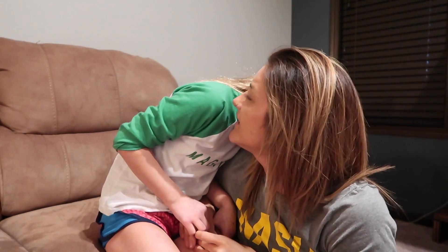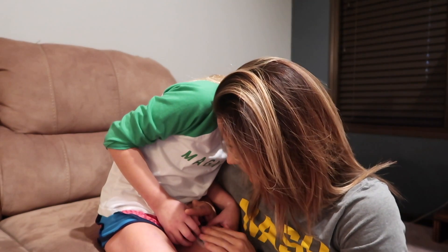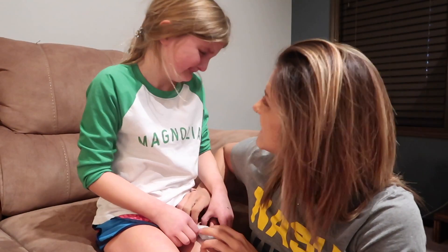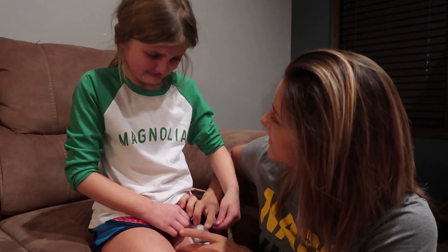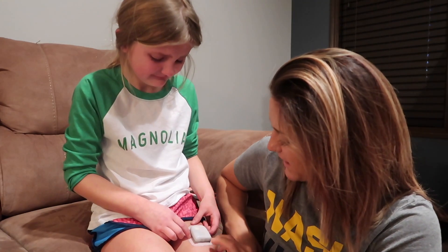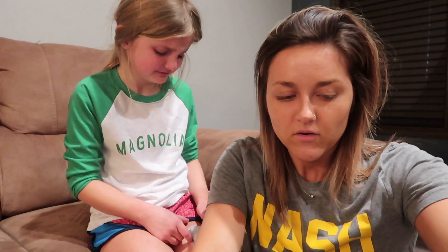Oh, I'm sorry. Why did that one hurt? I'm sorry, I didn't think that was going to be a bad one. You want to itch it? Did it just sting a little bit more? It hurts? I'm sorry — maybe it's just a weird spot. You always kind of put it in that spot. You okay? That was not a no hurt one today.